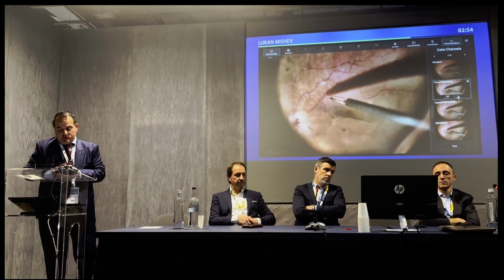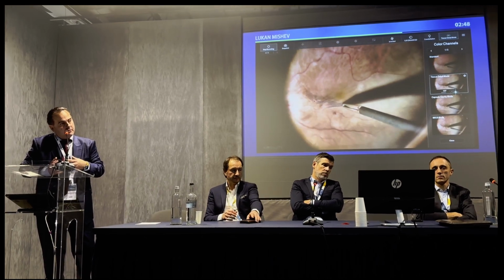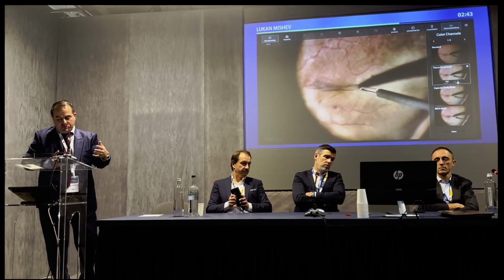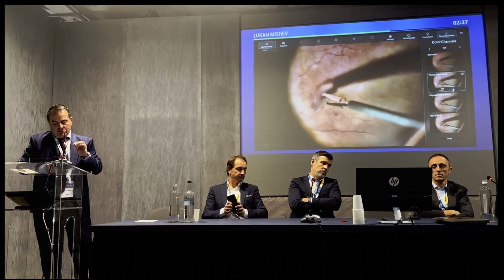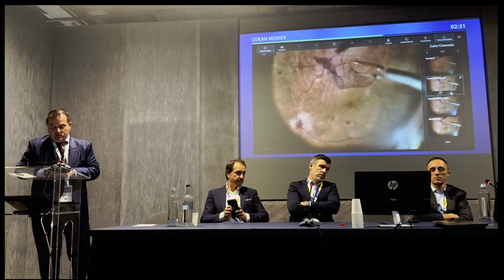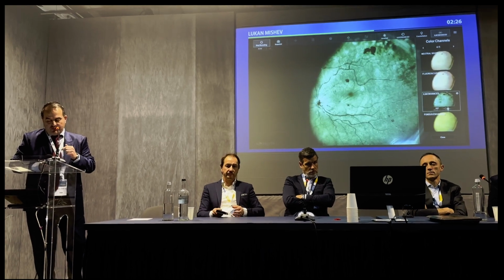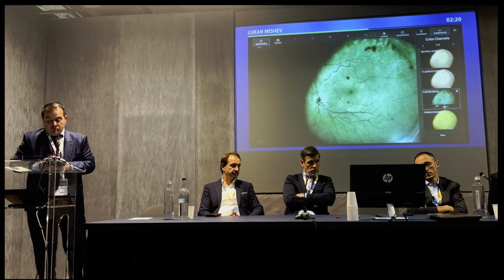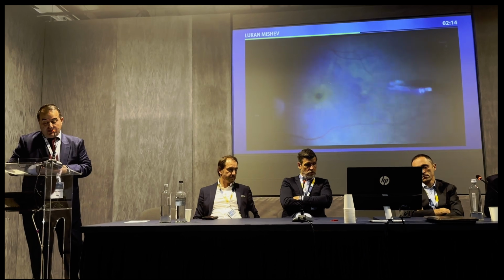Here we can see well how the image is digitally modified, but this is not necessarily a worse thing. I mean, it's a little bit different than our usual perception of the tissue, but we see highlighted exactly what we want to find and see here stained. So it can be useful. Here is a custom digital filter and the stepwise approach of enhancing the contrast. So I would encourage you to use your digital systems and play with them, because they can be really helpful.